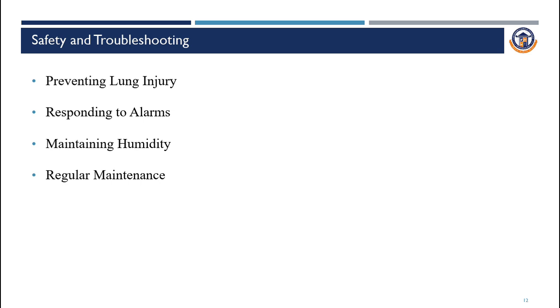For safety and troubleshooting in mechanical ventilation, effective communication among the healthcare team is essential to ensure safe ventilator management. Any changes in ventilator settings must be discussed and documented properly. Clinicians managing ventilators must demonstrate competency through regular evaluations. Ensure a functional bag valve mask is available at all times for manual ventilation during emergencies or in case of equipment failure. Ensuring safety in mechanical ventilation requires a multidisciplinary approach that combines proper training and effective communication.